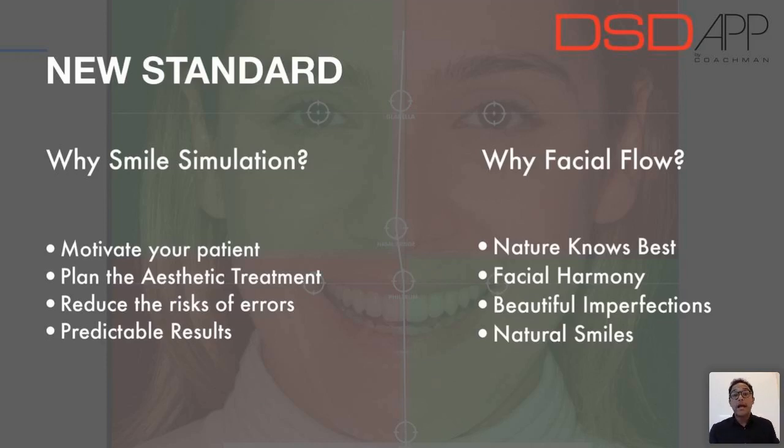And why do we do smile simulations? We do smile simulations so we can motivate our patient, so we can plan the aesthetic treatment plan, so we can reduce the risks of errors, because you're creating this smile design even before the patient actually accepts the treatment. By showing that before and after, you can engage the patient with that picture, and the patient can see exactly how their smile will look, how harmonic their smile will look. And with that, you can deliver predictable results.